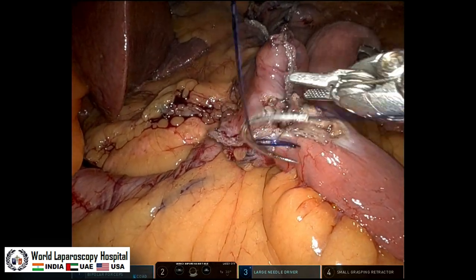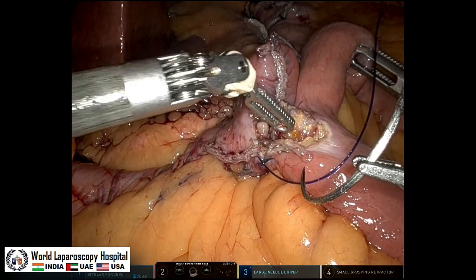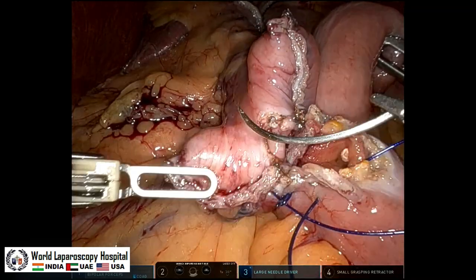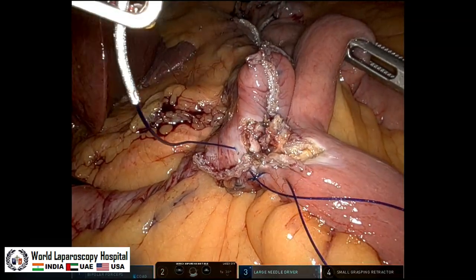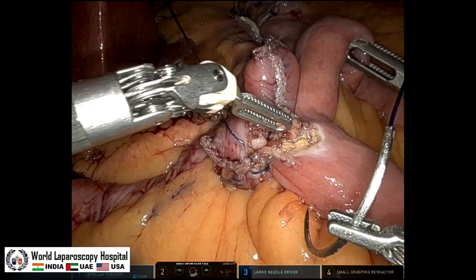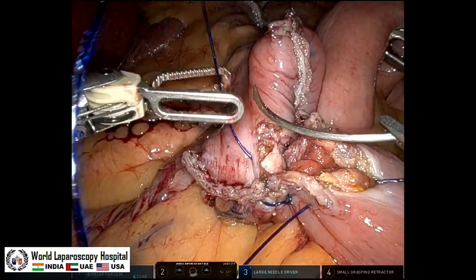So here now we are doing suturing. That is the best part of robotic surgery. And it's very, very easy in small spaces. The concept of C and J, which you always need to follow in laparoscopy, is not a problem here in suturing. Here you can hold the needle the way you feel like and you can manipulate and maneuver and you can do the suturing. Yes, so that is actually the advantage.